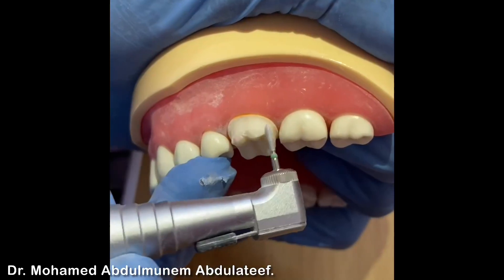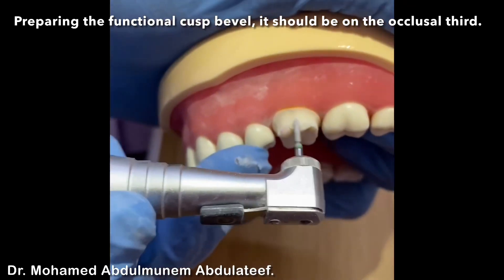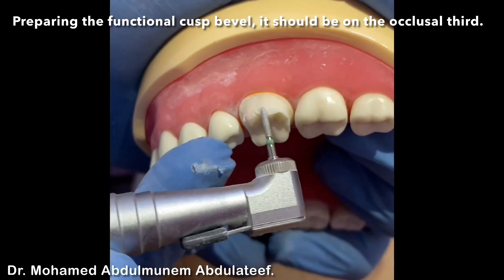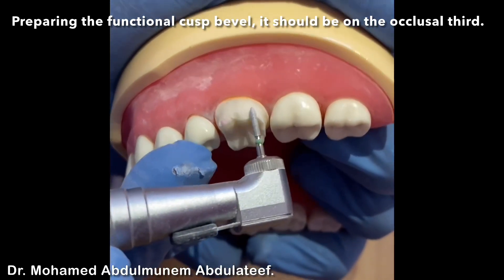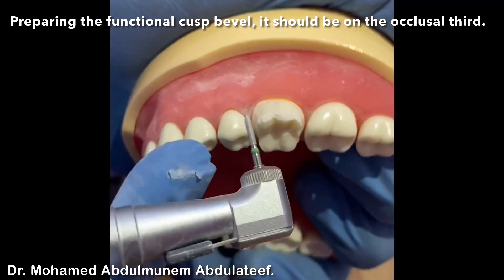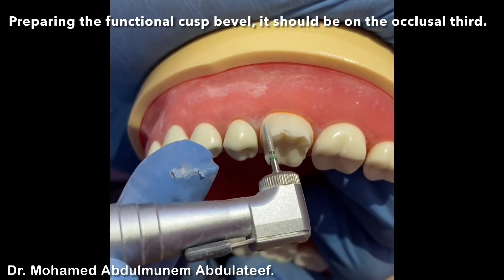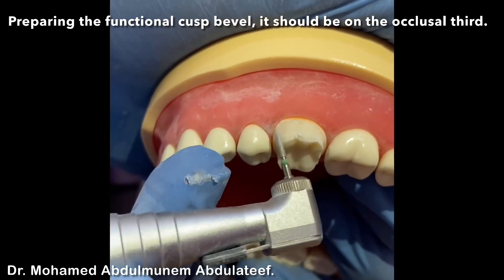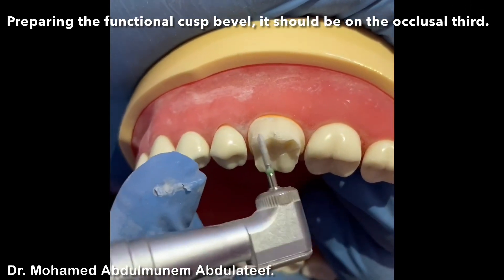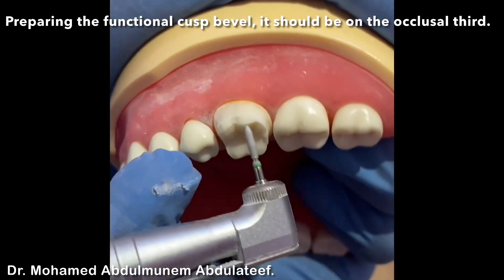The occlusal reduction should be a two-plane reduction — we already did the gingival and middle plane reduction. Now we are going to the occlusal plane reduction, which is the beveling of the functional cusp. This is the beveling of the functional cusp, following the inclination of the cusp.